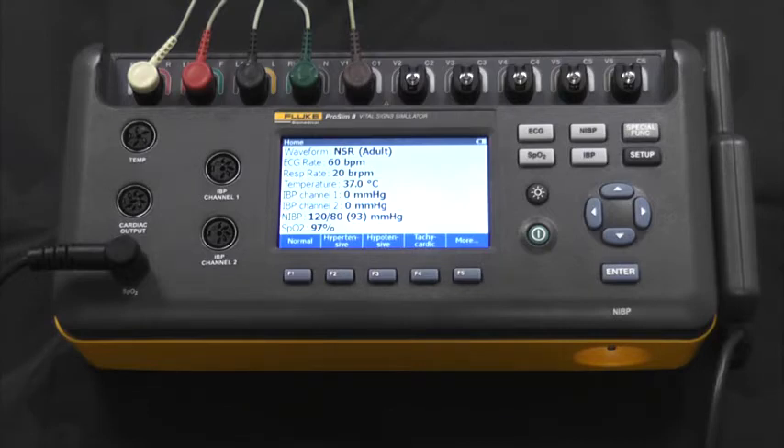The ProSim 8 simulates ECG functions, respiration, invasive and non-invasive blood pressure, temperature, cardiac output, fetal simulation, and SpO2.